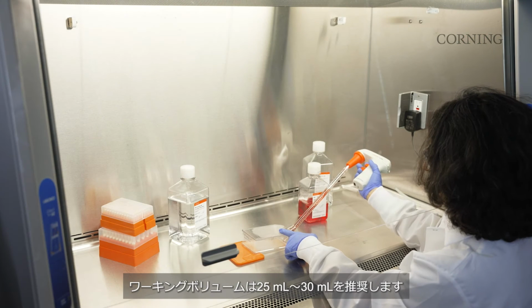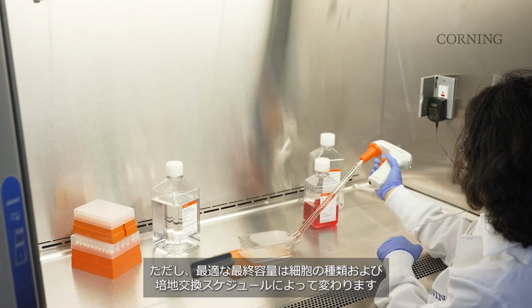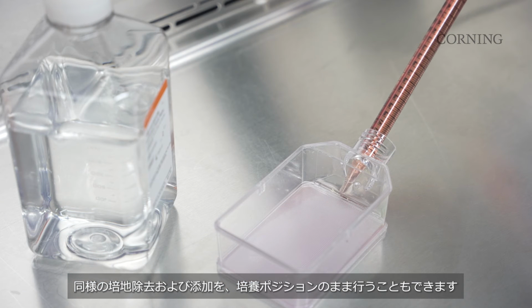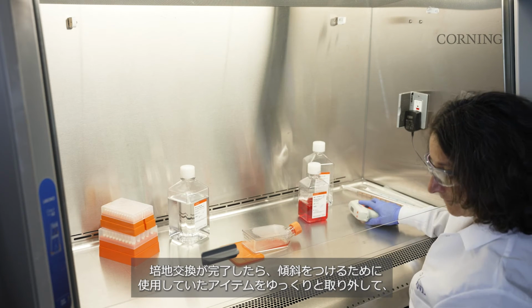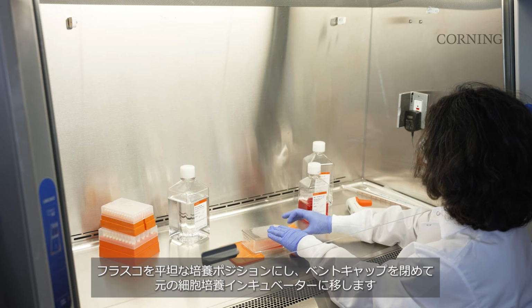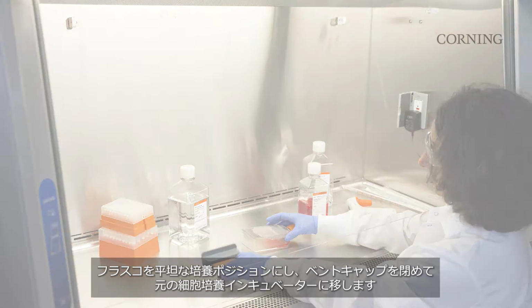A working volume of 25 to 30 milliliters is recommended. However, optimal final volume will depend on cell type and feeding schedule. Similar medium exchange can be done, leaving the flask in the incubation position for media removal and addition. A residual spent medium volume of approximately 2 milliliters will be left in the vessel. Once the medium exchange is complete, gently remove the angling device and bring the flask back to the flat incubation position. Recap and transfer back to the cell culture incubator.